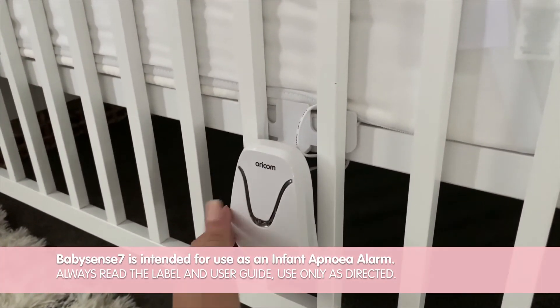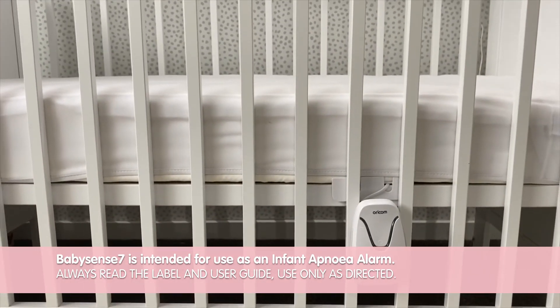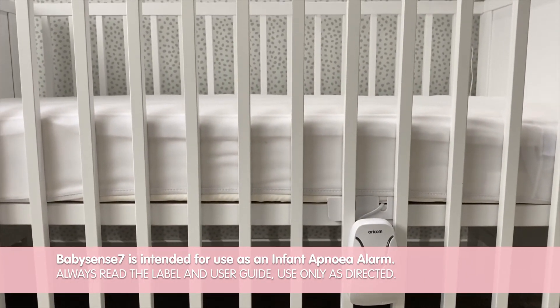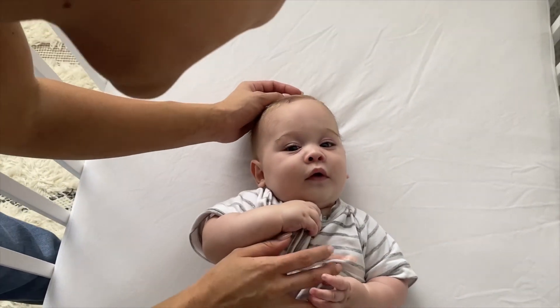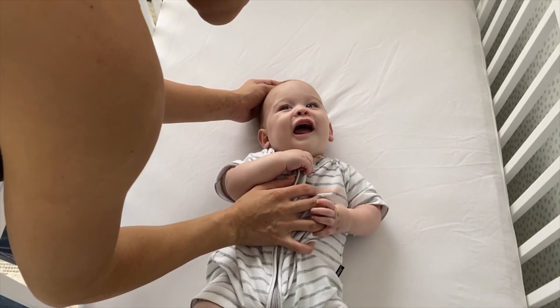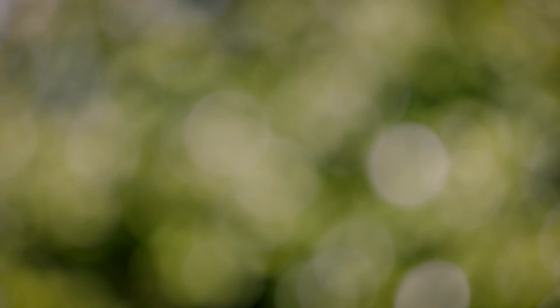A quick daily performance test is to be carried out, as well as each time the monitor is moved, the bedding is changed, or the cot is relocated. So there you have it — it really is that easy, giving us that true peace of mind. Thank you Oricom for designing innovative devices that us parents love, that are truly second to none.